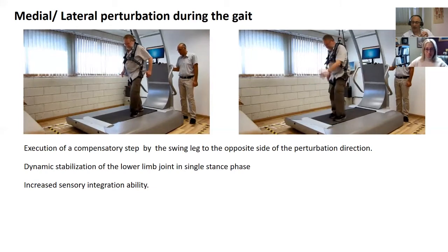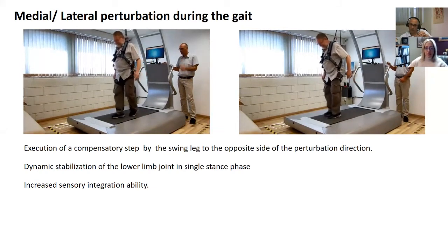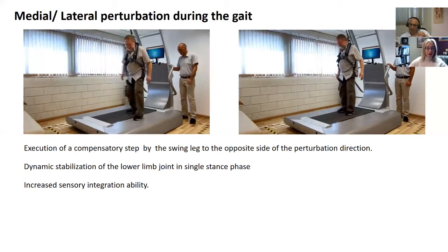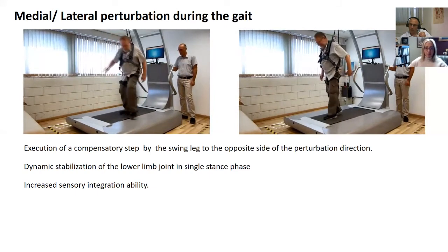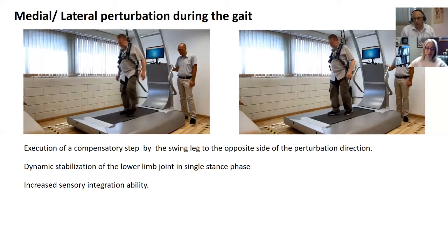That one there, yeah. Yeah, on that one there. Mm-hmm. So it takes a definite coordinated movement pattern to be able to tolerate that. And that's just a progression of what we just saw on the last slide of him standing still and trying to take a step to the side or try to maintain his balance.